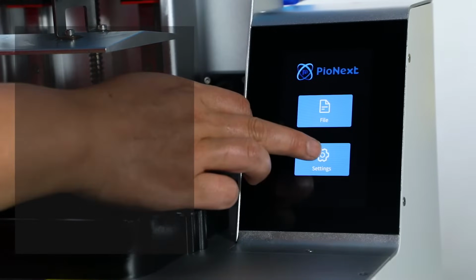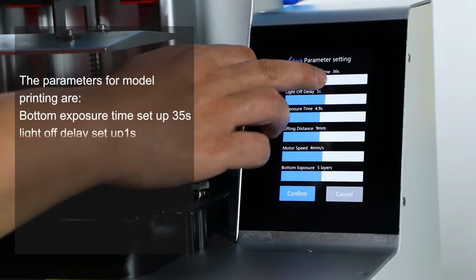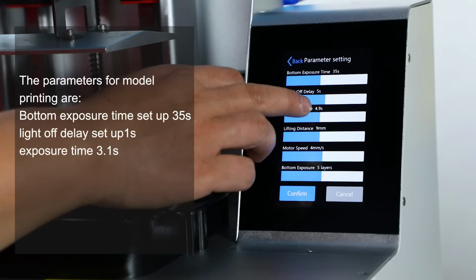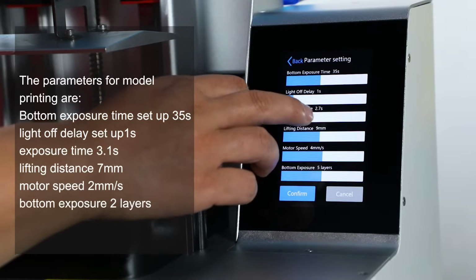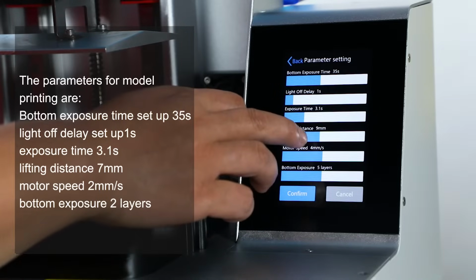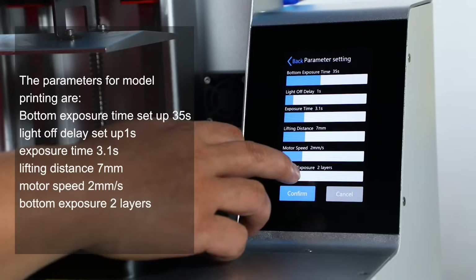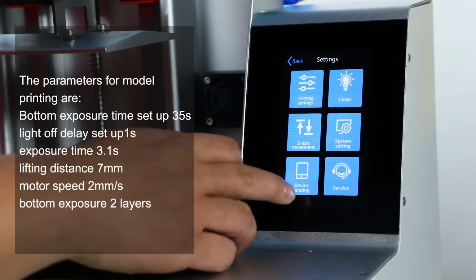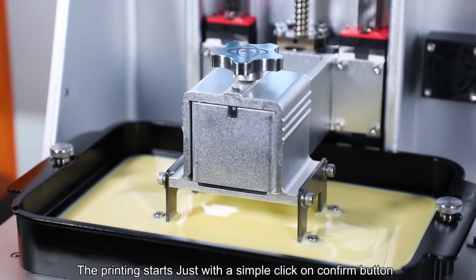The parameters for model printing are: bottom exposure time setup 35 seconds, light off delay setup 1 second, exposure time 3.1 seconds, lifting distance 7 mm, motor speed 2 mm per second, bottom exposure 2 layers. The printing starts with just a simple click on the confirm button.